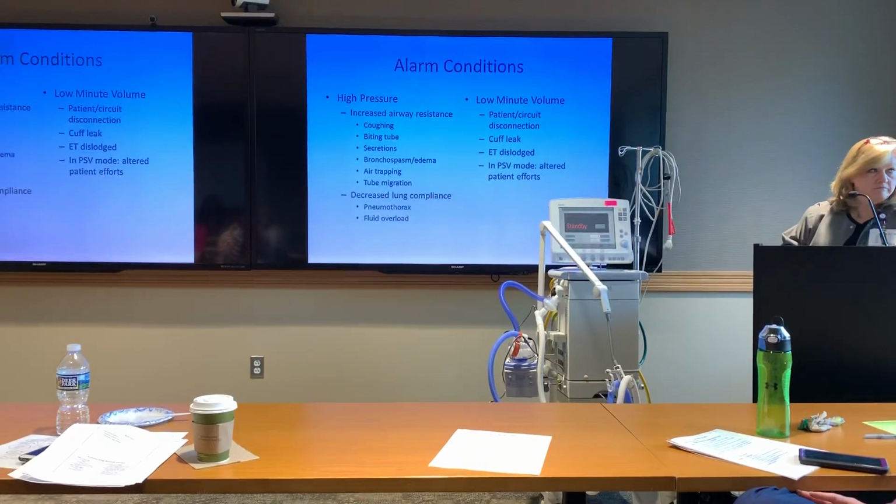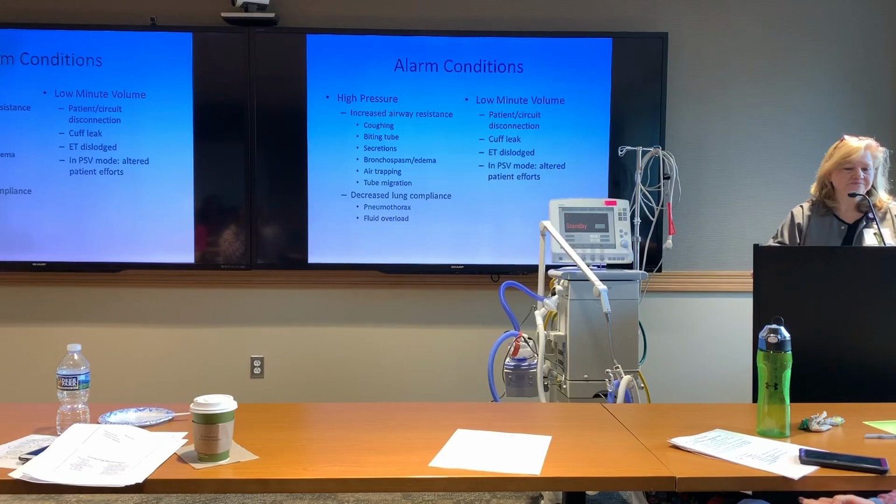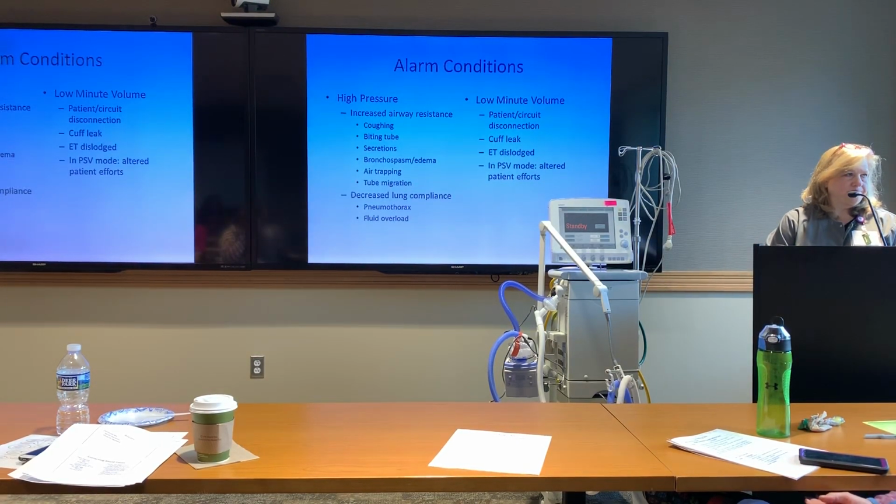I want to point out, I had a patient one time where the respiratory rate on the vent was actually showing like 50, the total rate. And then if you look at the patient, there's no way he was breathing 50. Autocycling, yeah. It turned out something was wrong with the vent, but I was training someone at the time and they didn't recognize that this was actually a vent thing. So I just want to point out, this is how the vent is saying how fast the patient's breathing, but don't forget to look at your patient.